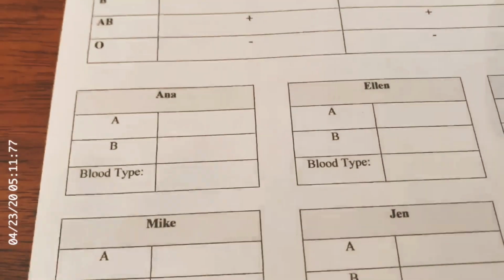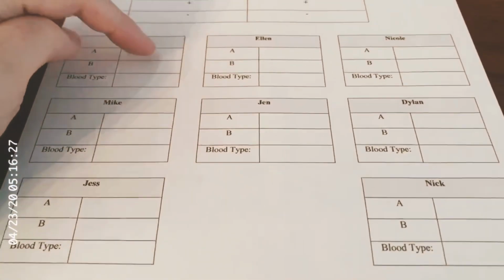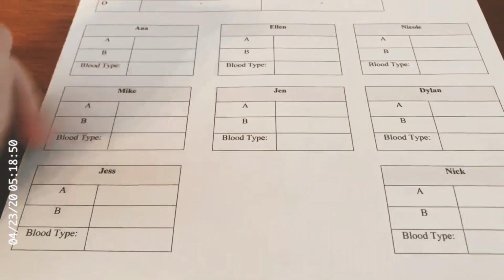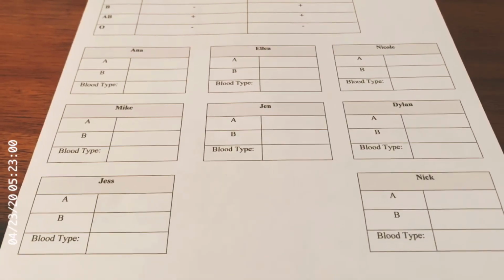So now we're gonna go ahead and test all the blood of the family members. You can write pluses and minuses and then figure out the blood types and write them down for each person. And then we'll figure out who can donate to who in the family.